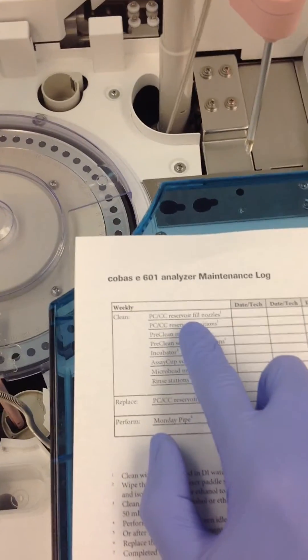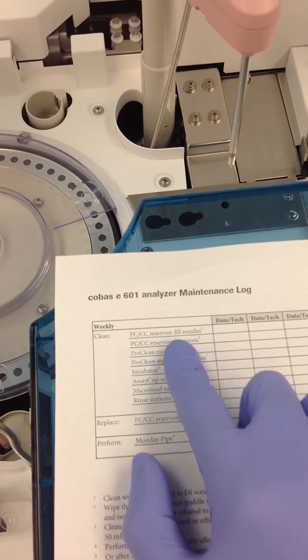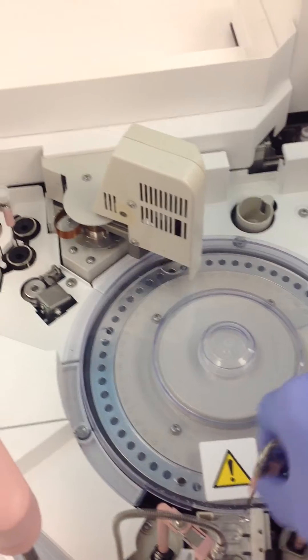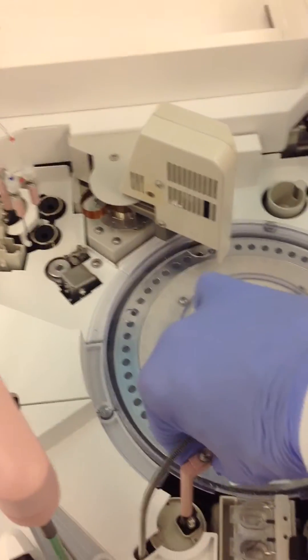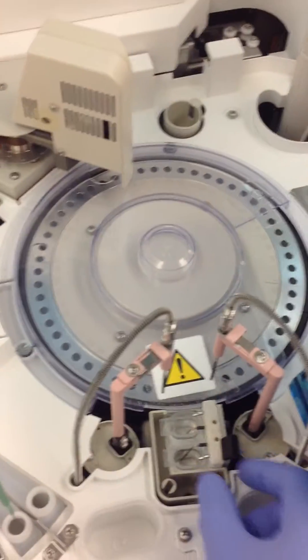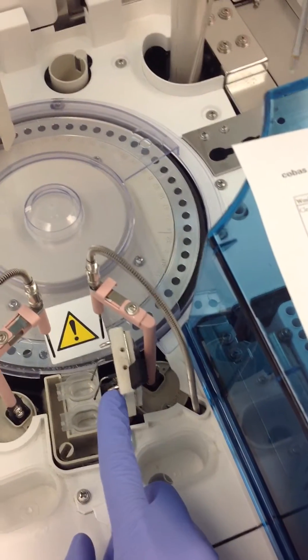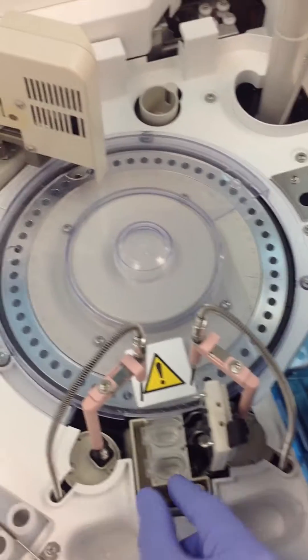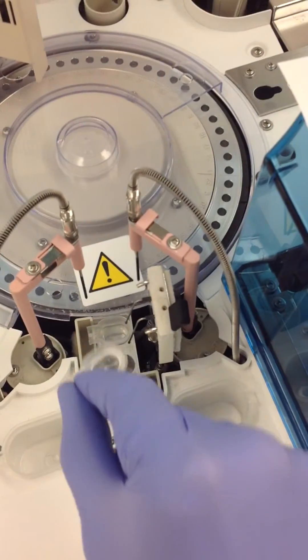So remove the cover. Step one is to clean the PCC reservoir fill nozzles — move the zippers out of the way. The nozzles we're talking about are these ones right here. You can do that easiest by pulling it up, and you can clean that with DI water. You also need to replace the PCCC reservoirs — they just come right out. Throw those away and put the new ones in.